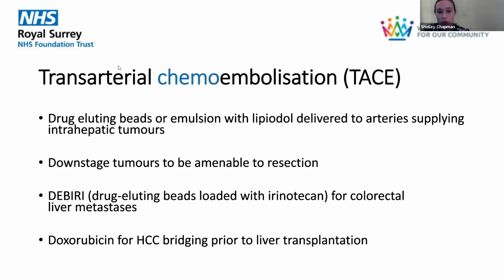We also performed transarterial chemoembolization, known as TACE, and this is either drug-eluting beads or chemotherapy mixed with Lipiodol into an emulsion and delivered distally in the distal artery supplying intrahepatic tumors. And we can do this to downstage tumors to make them amenable to resection. We also do this in HCC patients as a bridging treatment for patients who are on the liver transplantation list.